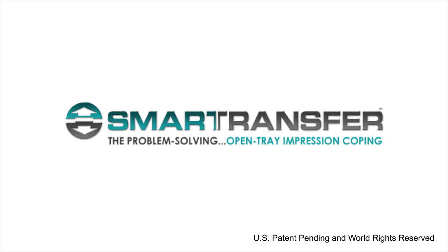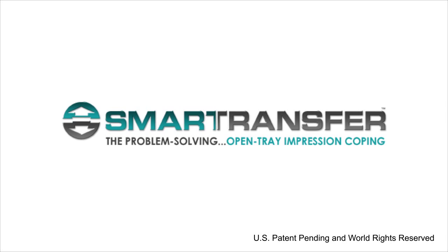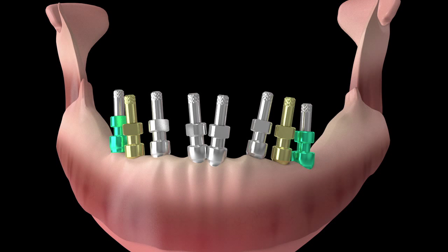Smart Transfer Impression Copings are an excellent solution when attempting to record divergent implants. When implants are placed divergent, it may be difficult to remove the impression with conventional copings. If you've ever had an impression tear when you removed it, you're not alone.